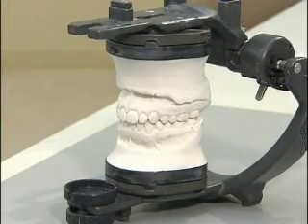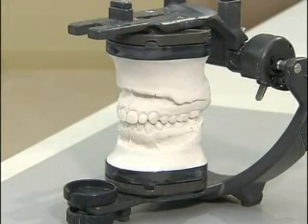Once both models have been polished, they are now ready for presentation. This completes our demonstration. Remember, excellence is dependent on the quality of the previous step.